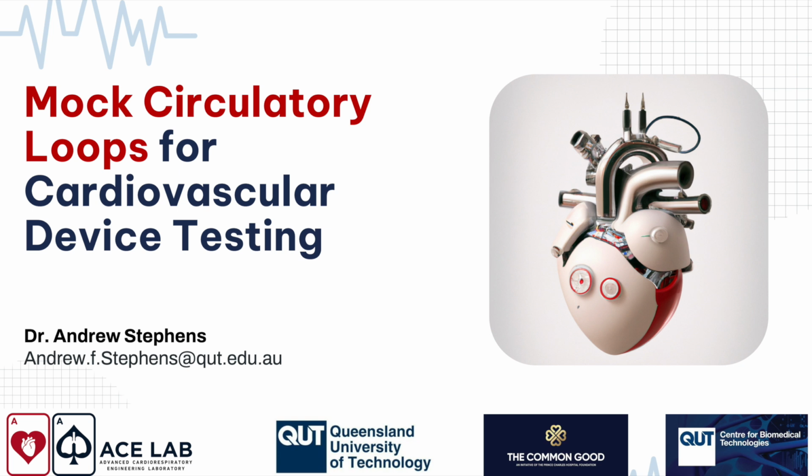So the advantages of a mock loop is that it's cheap compared to animals, it's highly repeatable, it's highly controllable, and it's very easy to instrument. It's much easier to put more sensors on a mock loop than it is to put more sensors in an animal or human. So we can get actually a lot more data out of these than some of those other models. The disadvantages are that it can't model all of the biological processes.